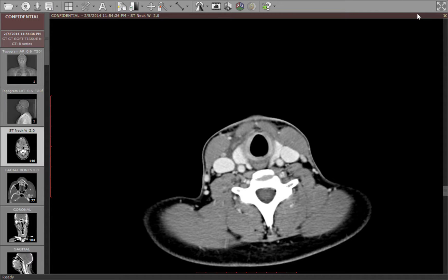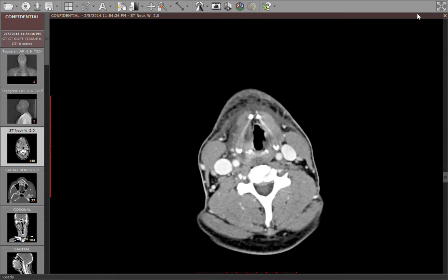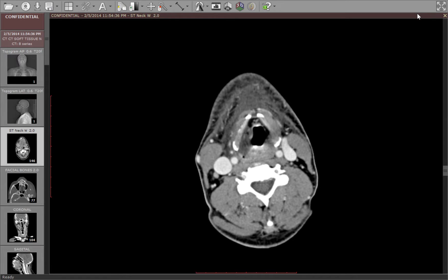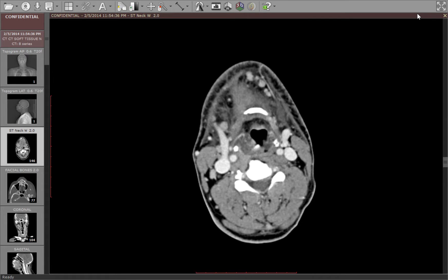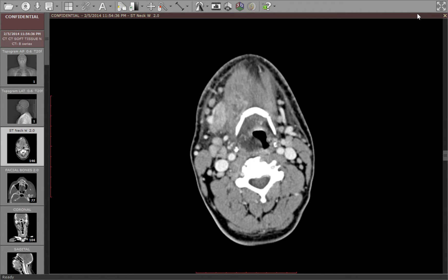This gentleman came in with a chief complaint of a sore throat. A contrasted CT of the neck was obtained. Scrolling through axial slices, you can see in the submandibular space, particularly on the right, there are multiple lymph nodes and some stranding.